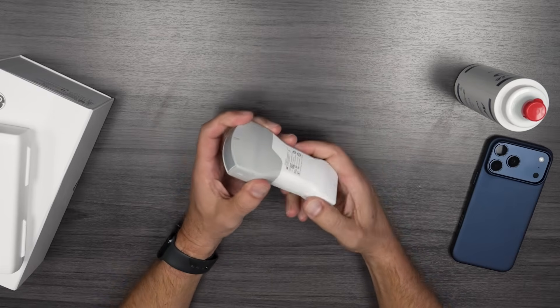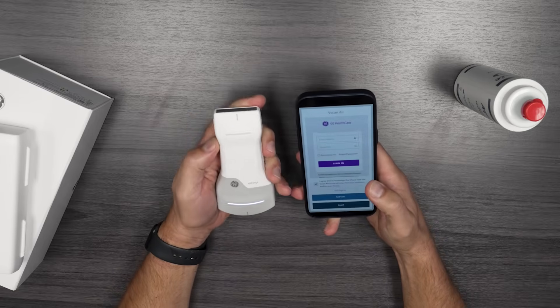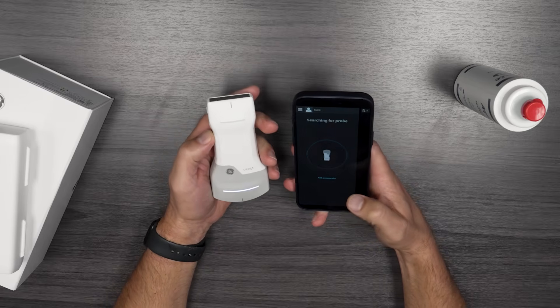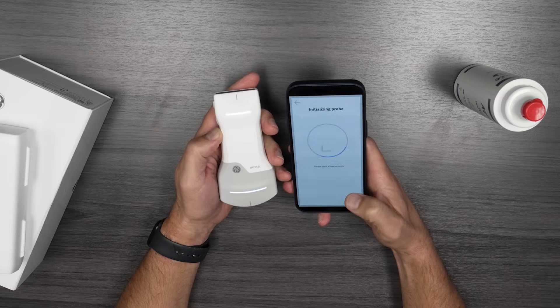To get started, it's pretty easy. Just hold down the button and the app should already be up. You connect to the app, sign in as a guest, and it says it's looking for a probe. You add a new probe, it says go ahead and turn it on, then wait for it to connect.